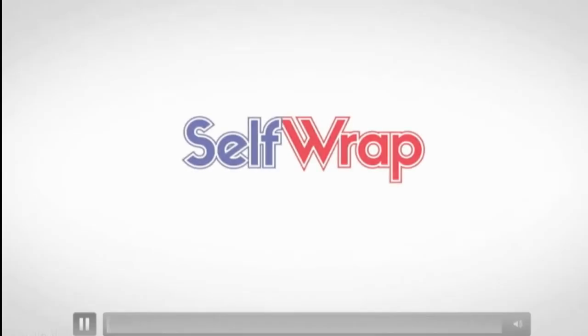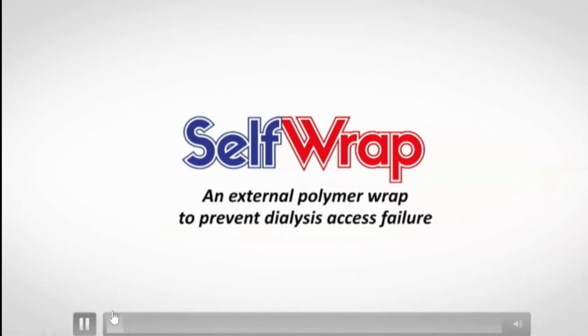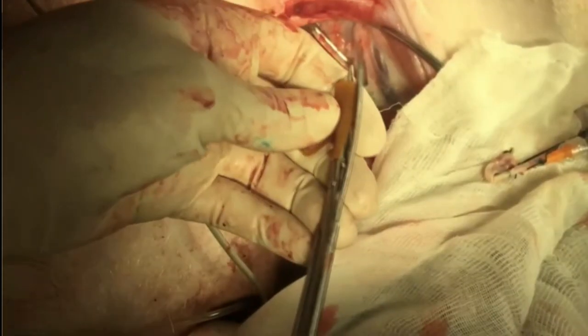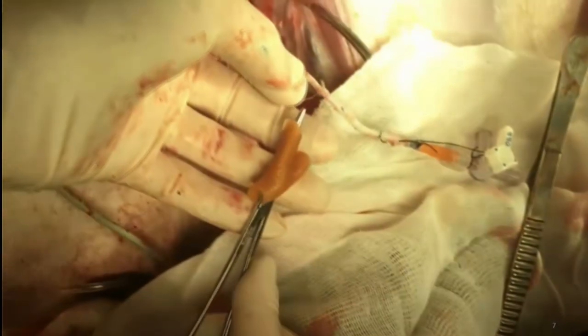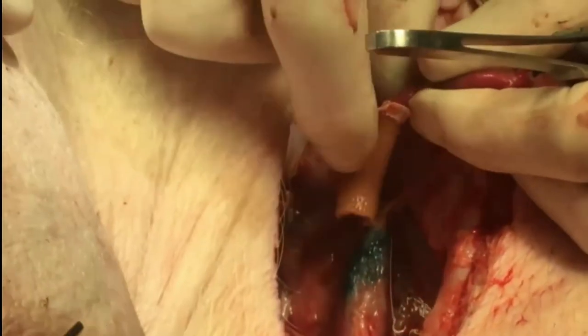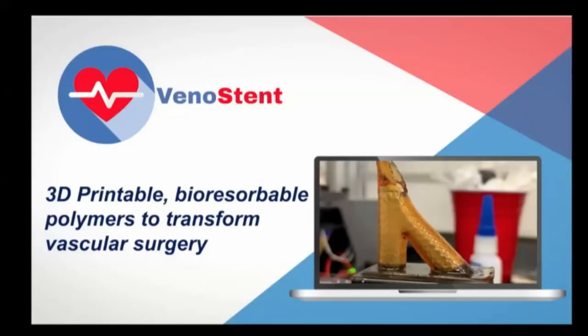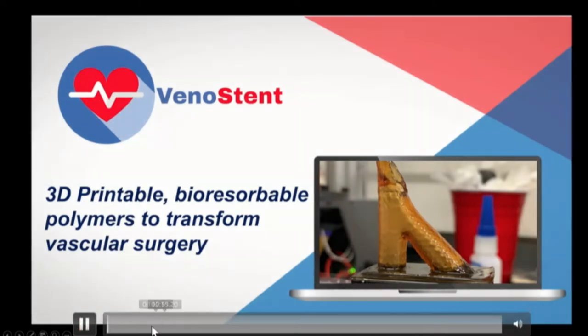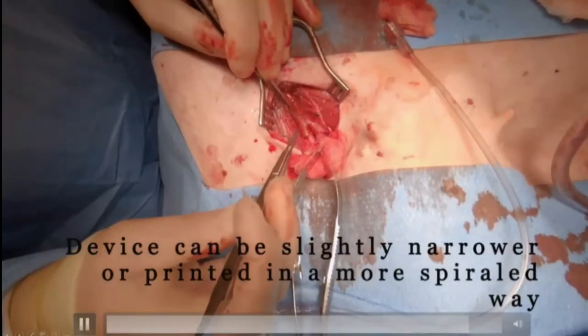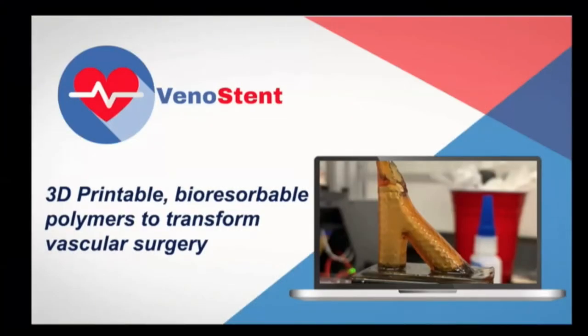You can see how it is applied in this video. Fast forward to where this is done. In the surgery done in the arm, where you have an artery vein connection, it just slides up there, as you can see in the video, and then you just slide it down over the anastomosis. This was a non-survival pig experiment in December 2018, showing how we can implant our device, sliding it down once that artery vein connection is made, and it fits snugly over the fistula. We did an experiment in January of this year with Dr. Peden. It was really helpful in identifying some design changes we needed to make our materials more flexible, and to be able to fit it around that anastomosis area.